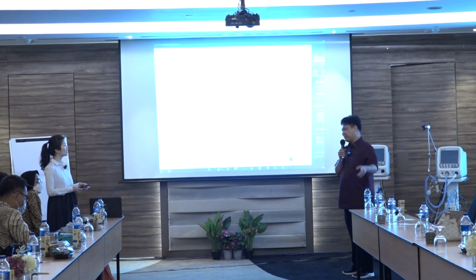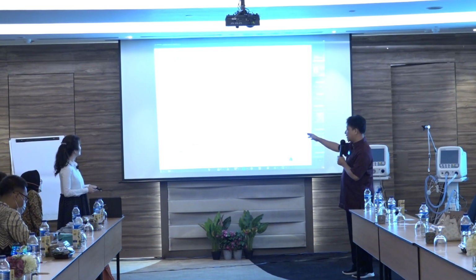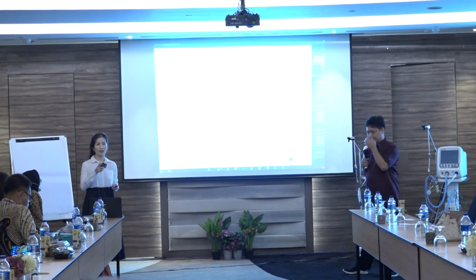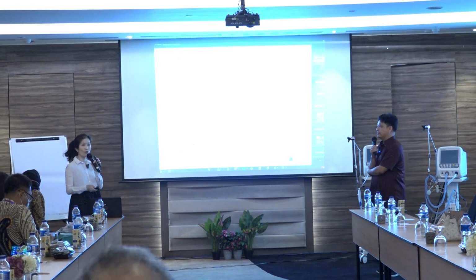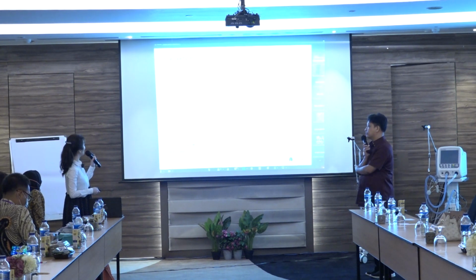Hui. My friend asked about FOT to another mode like conventional, because in this example this is always about HFO. She asked about that. We can use it for conventional mode also. So you will see that here, this one actually is for conventional mode.